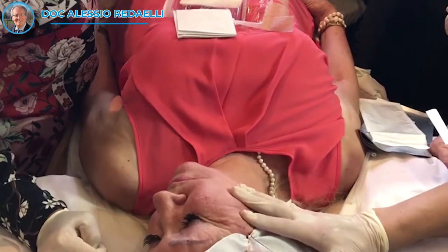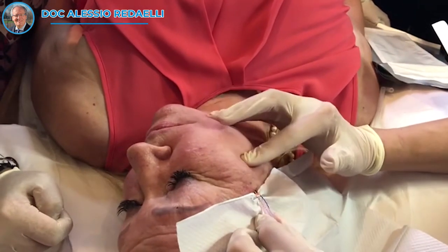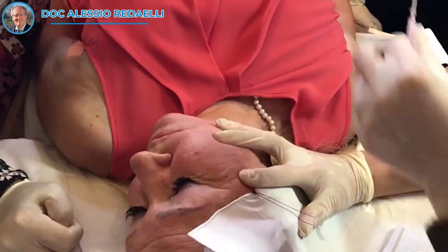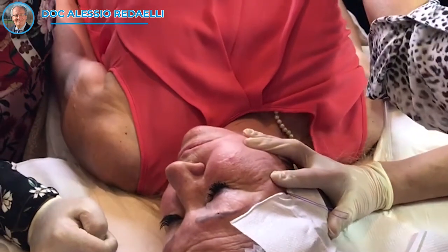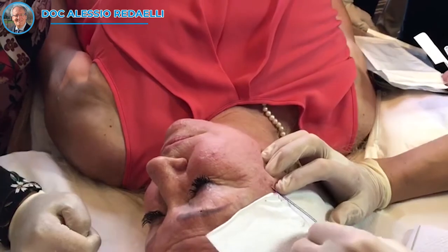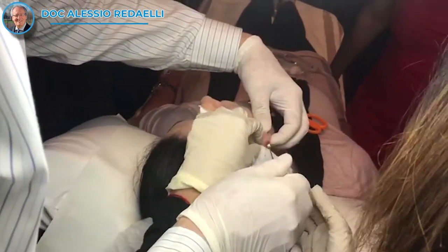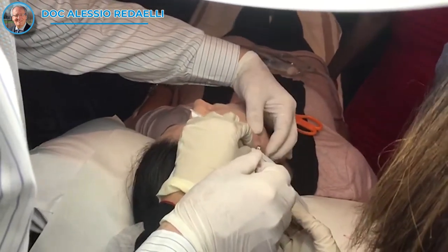We charge the tissue upwards, push it down just a little bit so that that first little hook can hook, and we pull out. It's quite thick — it's a very thick one. This is for a really strong pull. Here it is, very superficial. You have to find the subcutaneous tissue.